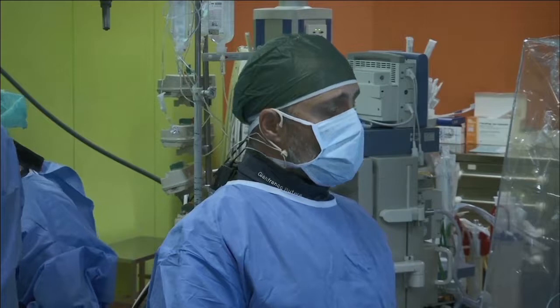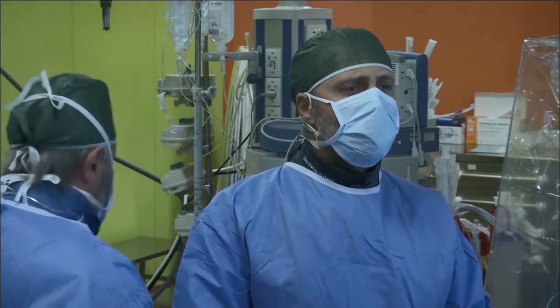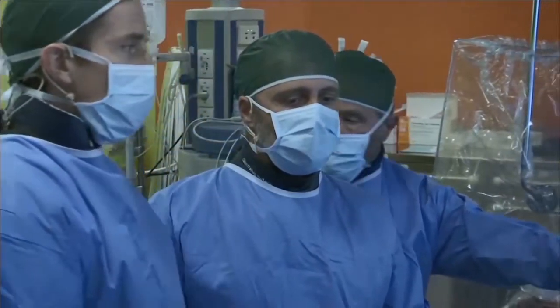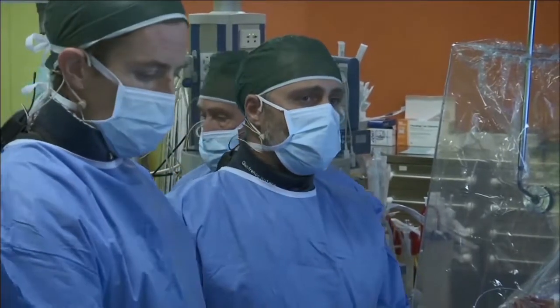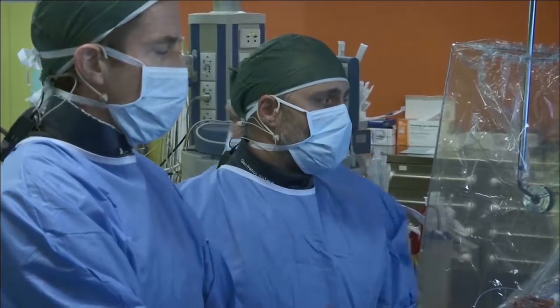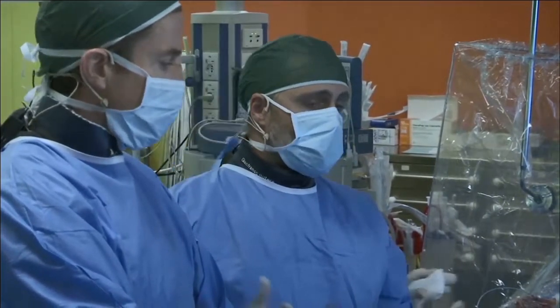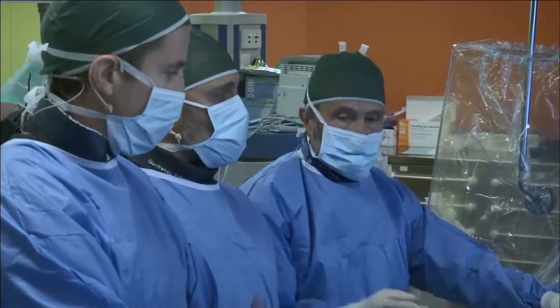And what our plan is to implant... what stent, the covered stent? How long, and what balloon delivery system are you planning to use? Yeah, I'm going to use a pre-mounted CP covered stent. The diameter will be 12, and the length will be 30 millimeters, through that 14 French long sheath.